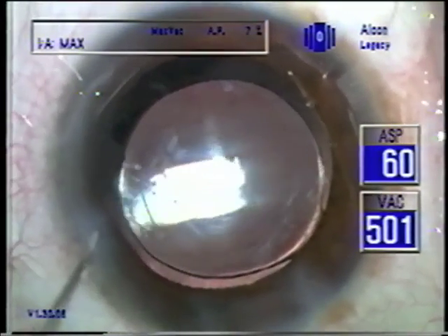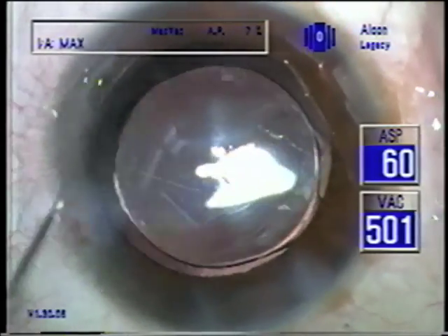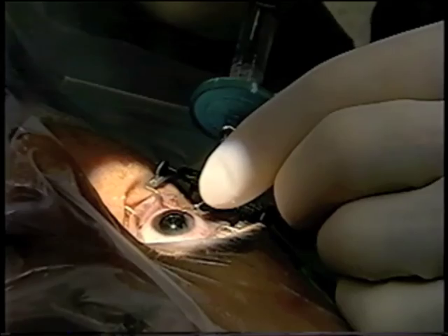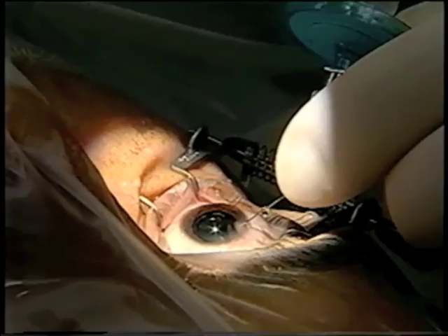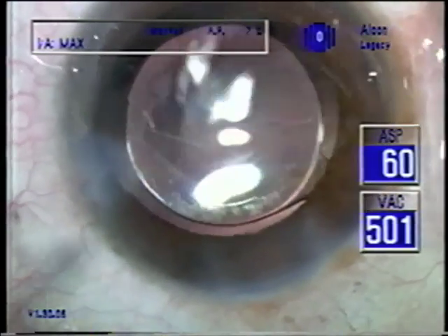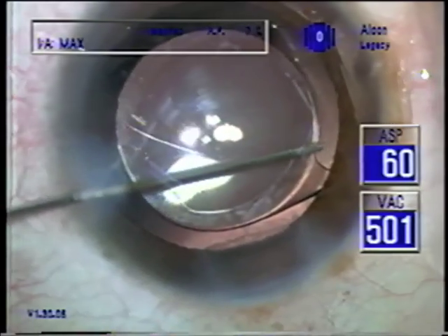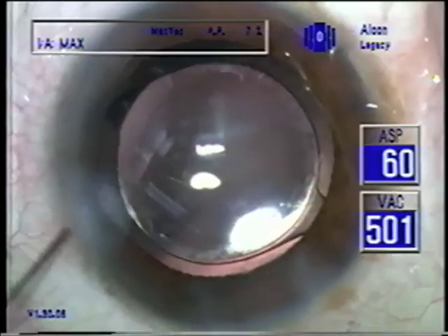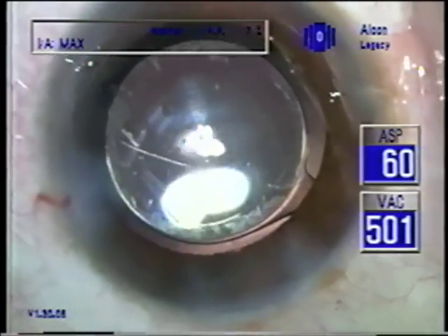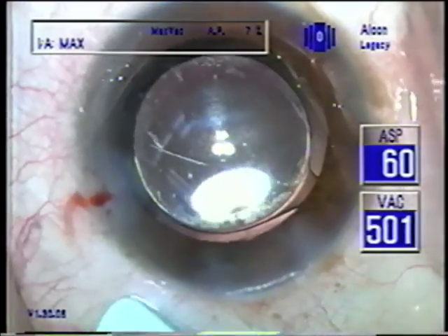This is one milligram in a tenth of a milliliter. Injecting the antibiotic into the bag? Yes — swirl under the IOL — and then forming the chamber now with more balanced salt to get the pressure ideal. Are the haptics fully expanded at this time? Sometimes they're not at this time, but the tackiness of the material attaches to the capsule well enough to keep the lens centered.